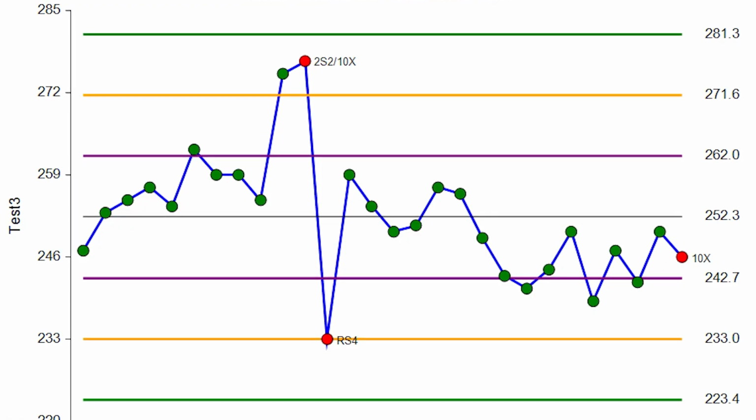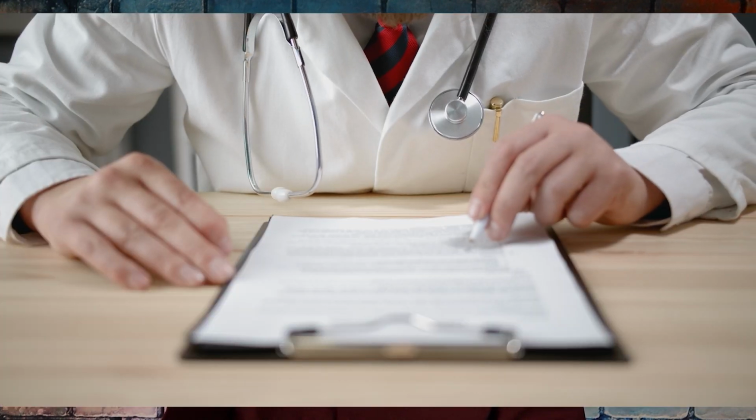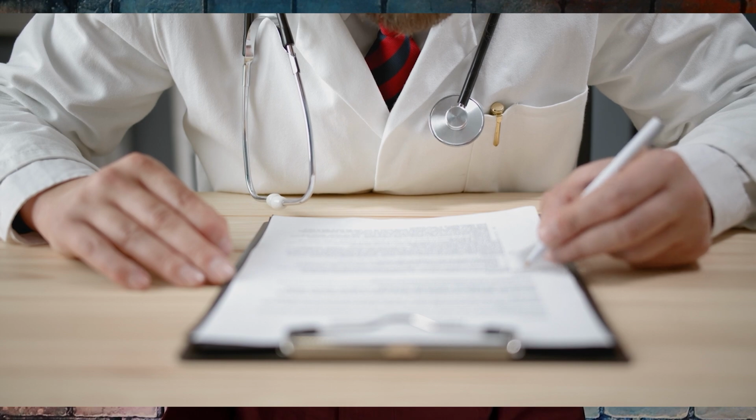Just to refresh ourselves, remember that quality control is really about the data that we might receive from analyzers and machines in the hospital that tell us data or specific numbers. That's important to us because we need to make sure the numbers that we get from these machines and analyzers are correct. Why? Because we're going to make changes to the patient care based upon that. So we always want to make sure that these machines are working correctly and that they're reporting accurately.